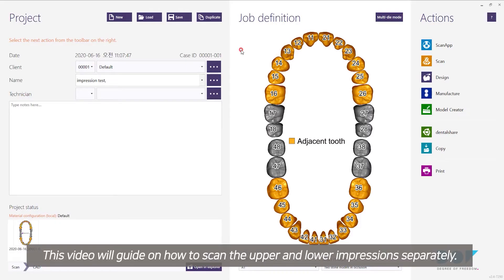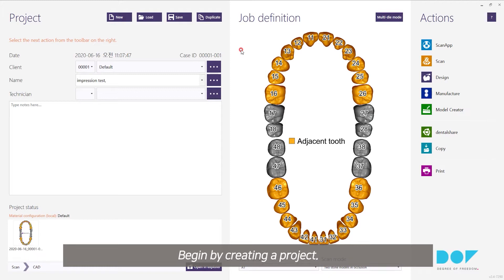Hello. This video will guide on how to scan the upper and lower impressions separately. Begin by creating a project.